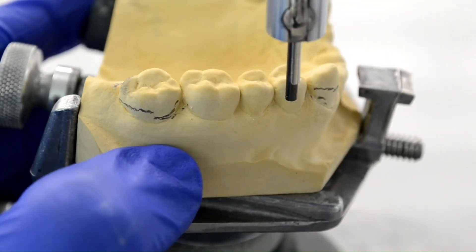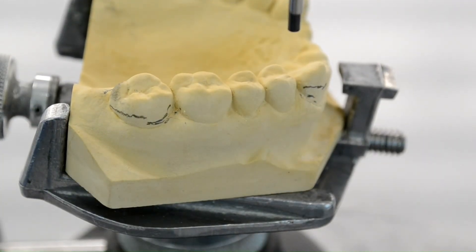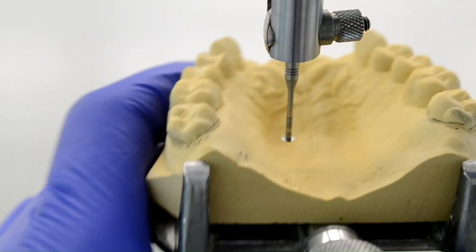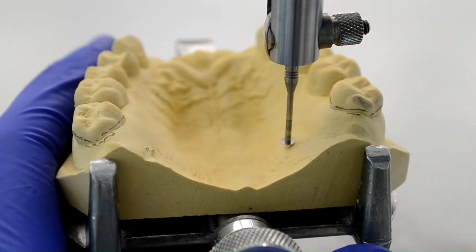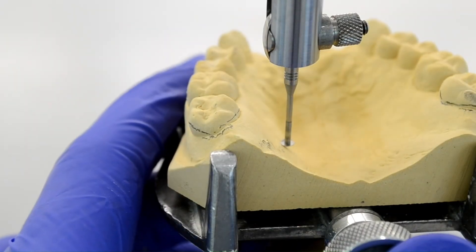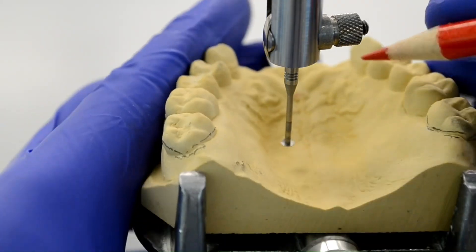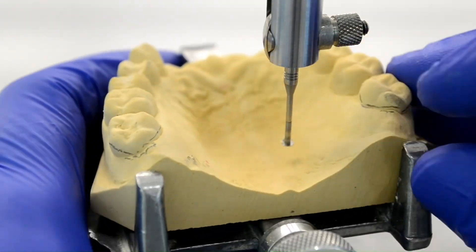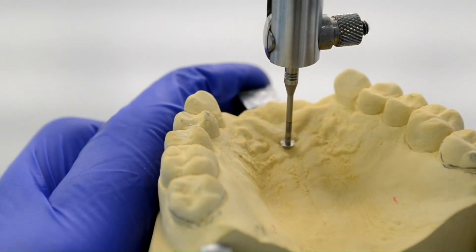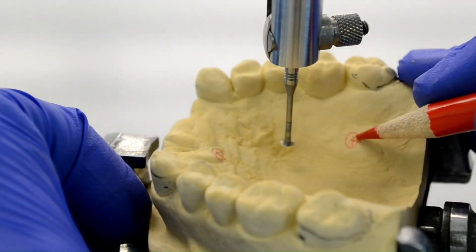With this, the surveying is completed, but in order to save the position of the cast, we need to tripod it. This is done using a 0.03 undercut gauge. The 0.03 undercut gauge is attached to the mandrel and the mandrel is lowered so that the undercut gauge can touch the cast at three different areas without having to move the mandrel up and down. A red pencil is then used to mark each area of contact on the three different points on the cast, and red circles are added for easier visualization.